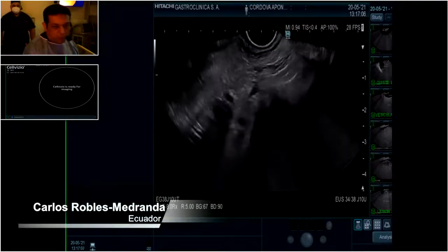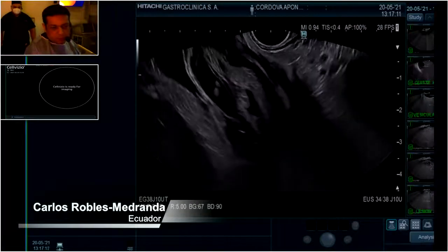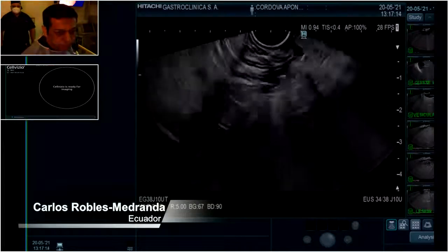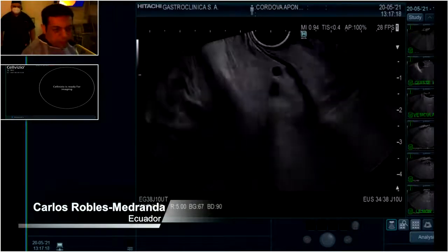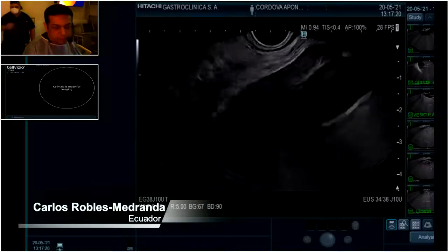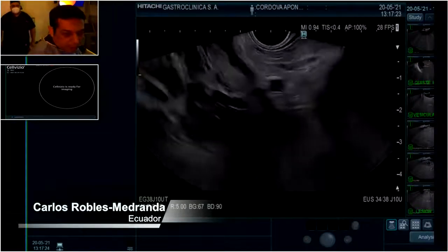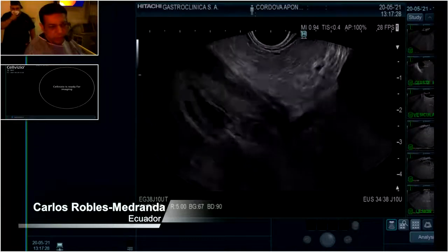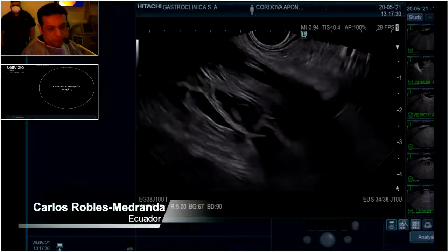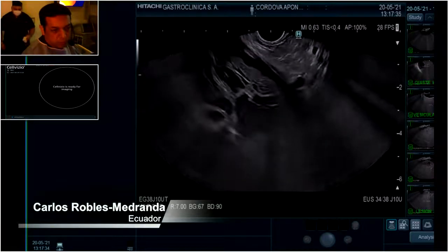So, hello everybody, welcome back. So, today we have an interesting case, and I would like to discuss a little bit how to deal with this kind of lesions now in 2021.